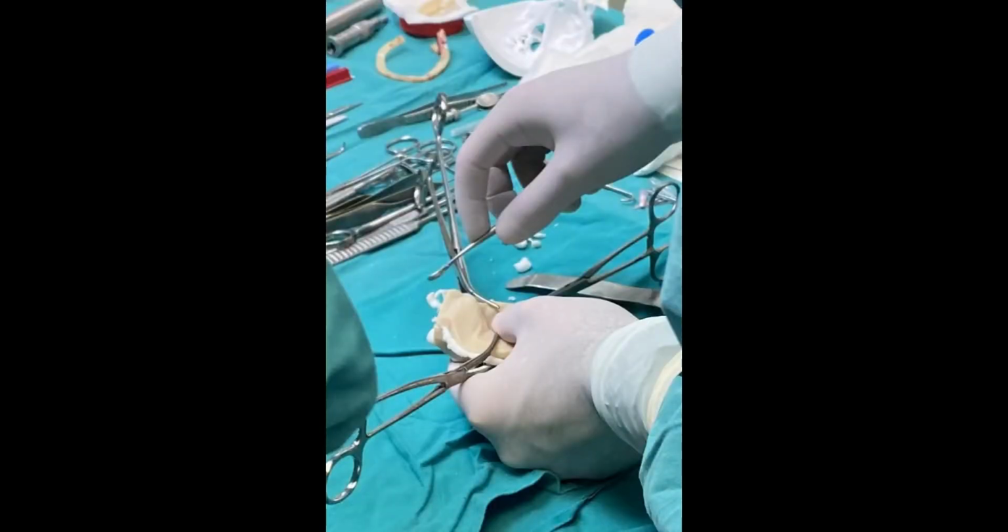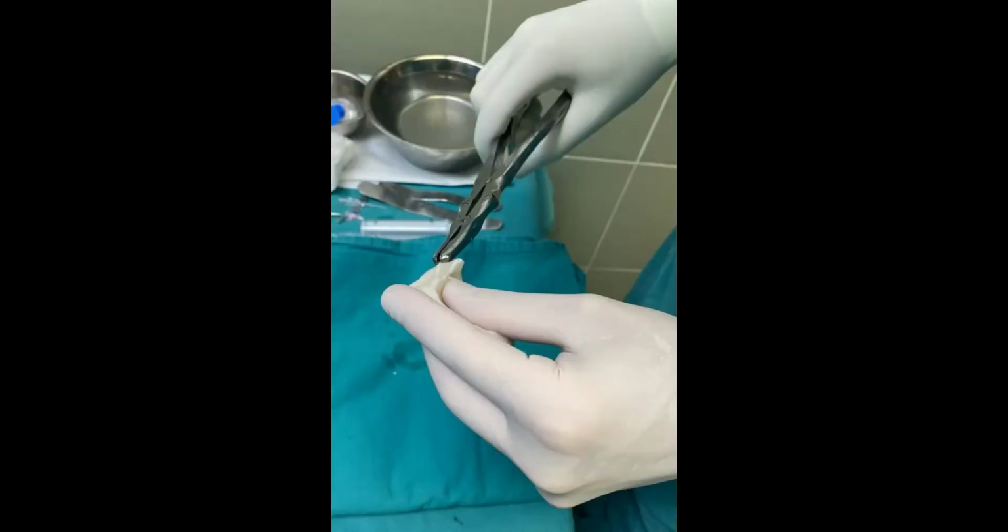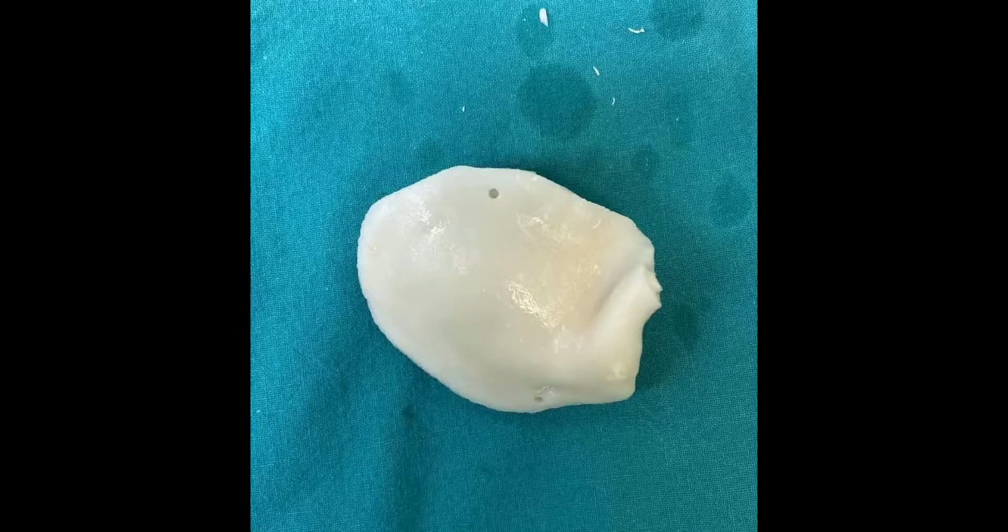The third picture is a close-up of the process. You can see the excess material exiting through the sides of the mold. Now you can see me removing the excess material from the sides of the graft. This is the final look of the graft before the implantation.